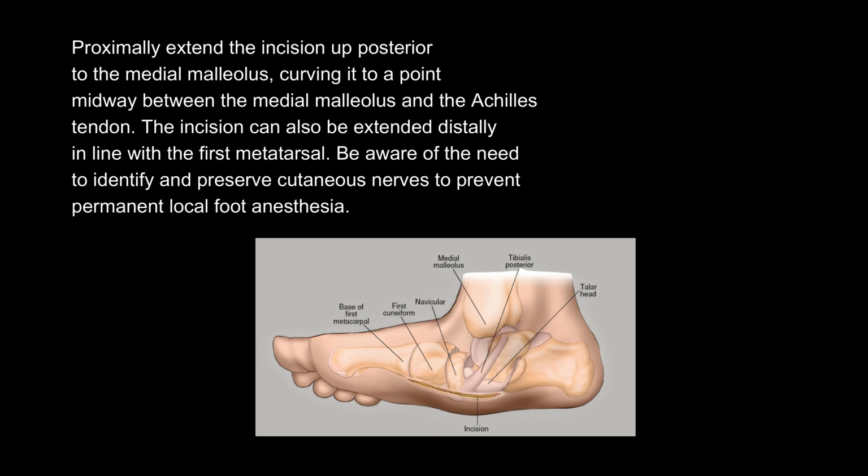The incision can also be extended distally, in line with the first metatarsal. Be aware of the need to identify and preserve cutaneous nerves to prevent permanent local foot anesthesia.